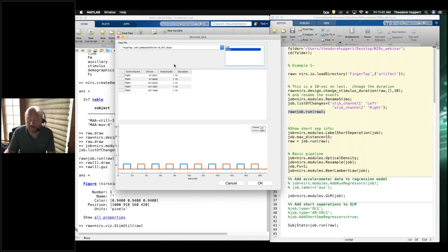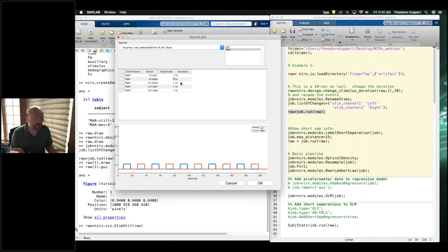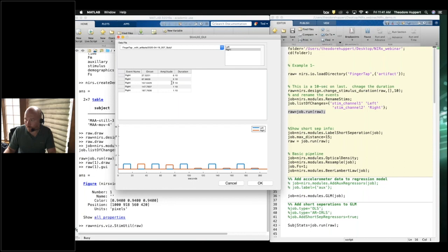The events have a name, an onset (when they started), a duration (how long they were), and a field called amplitude. Amplitude is a way to run parametric general linear models. Right now all amplitudes are one, meaning all trials get the same weight. But say I wanted to look at habituation effects — I might change the amplitude so it's decreasing across trials.